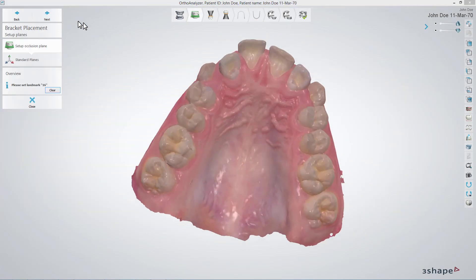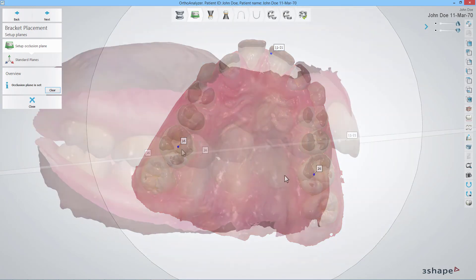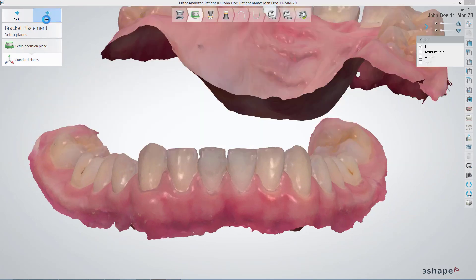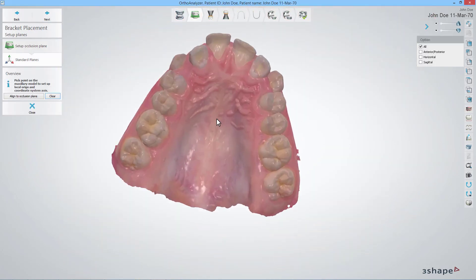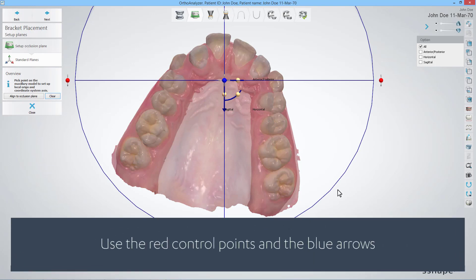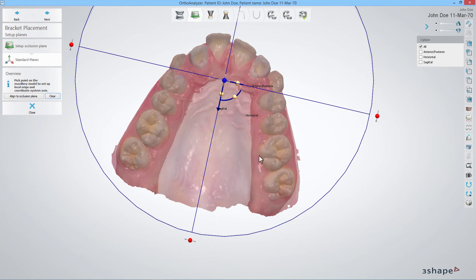Here you are able to set up occlusion plane and standard planes. First, follow the instructions on the left, clicking on the specific teeth to place landmarks on them. This will create an occlusion plane. In the standard plane step, click on the model to pick a starting point for the local origo and coordinate system axis. Now, use the control points and blue arrows to set the axis — just hold down the left mouse button and move the mouse to move them.